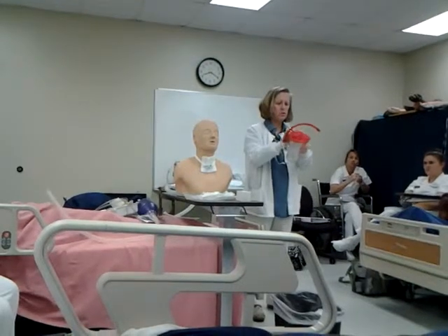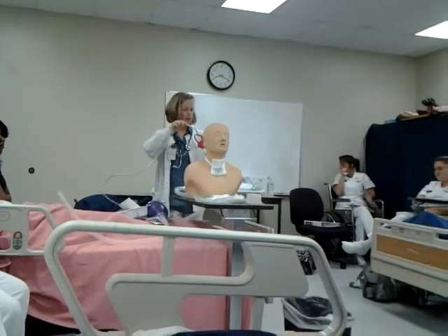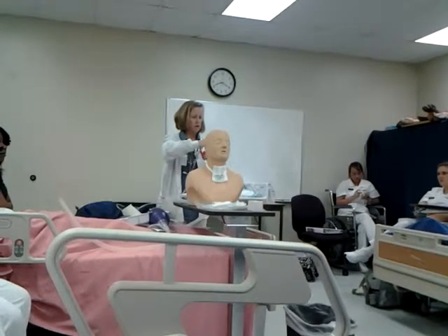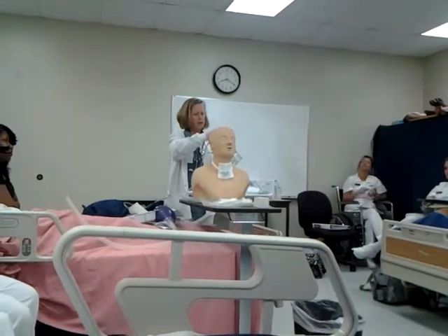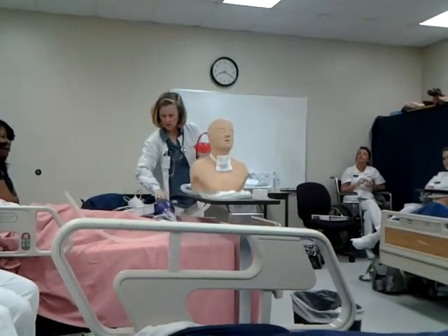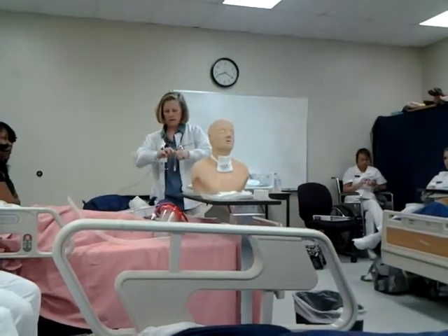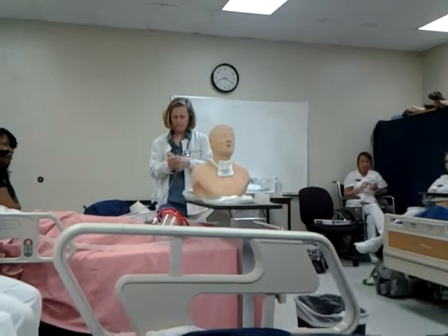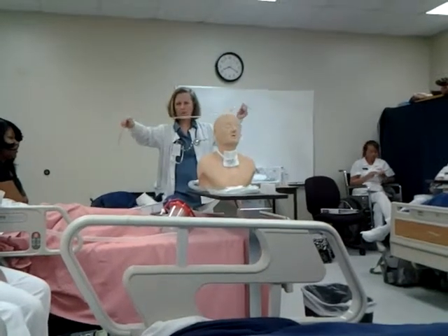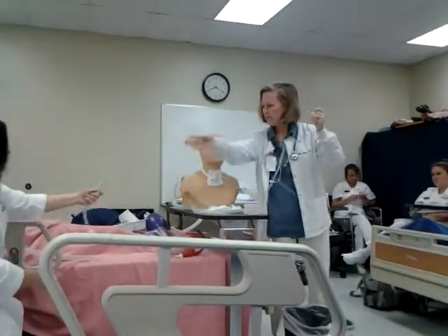And your tubing, this, and it's all labeled. It says to vacuum, to patient, so it gives you everything you need to know. So this will hook onto this. Do you think this is going to be sterile or non-sterile? Non-sterile. Maybe I'm going to have you just hold that so it won't fall off.